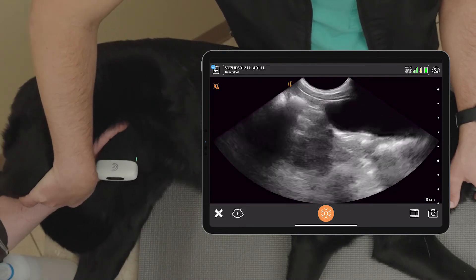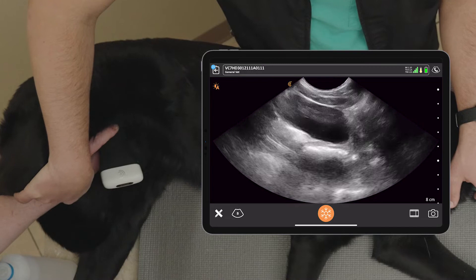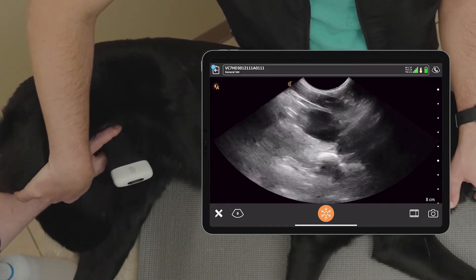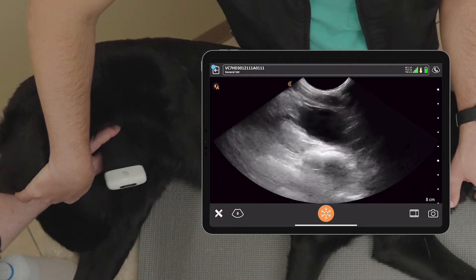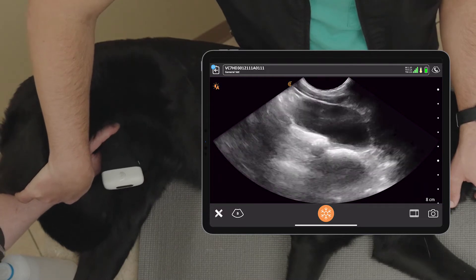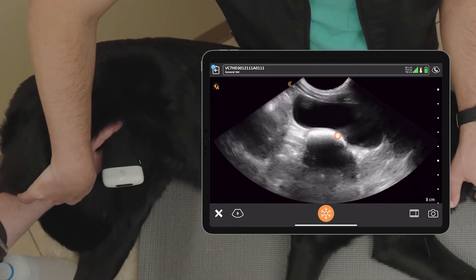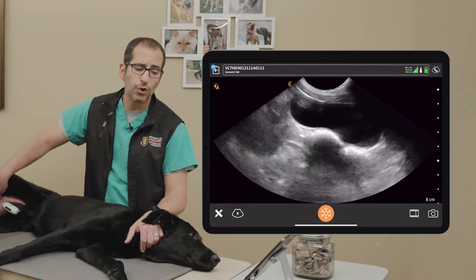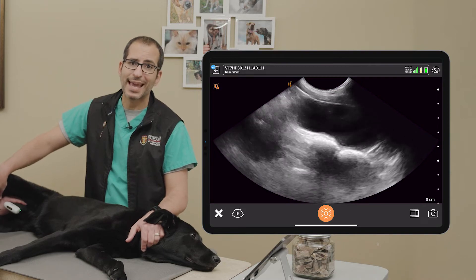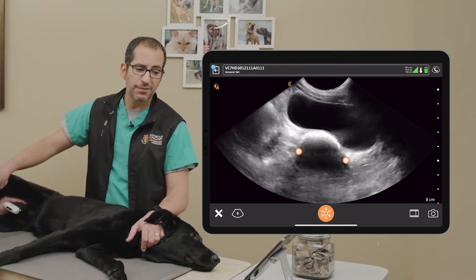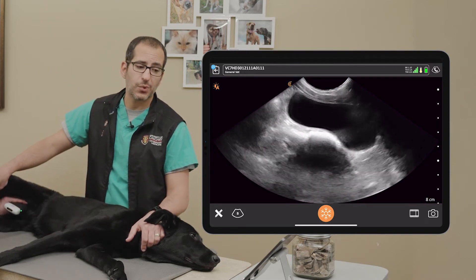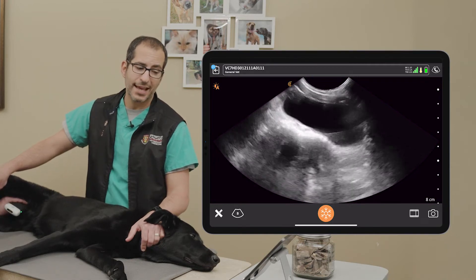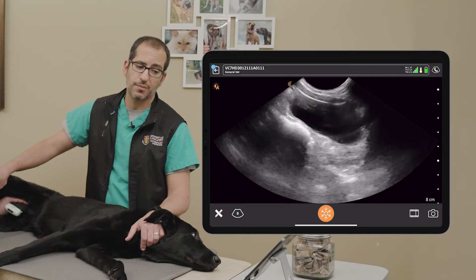The fluid accumulates at the apex. Then I will slide back and I'll check more in the trigone region. Make sure I fan all the way up one side, fan all the way up the other side until the bladder disappears. Now I've done that in long axis. Is that a stone that I'm seeing there coming right in the middle of the urinary bladder? That is the colon and you have to be careful with the shadowing gas in the colon — it gives off the impression that it is a bladder stone. This is why it's important to fan that probe to show that it is actually a tubular structure under the bladder.